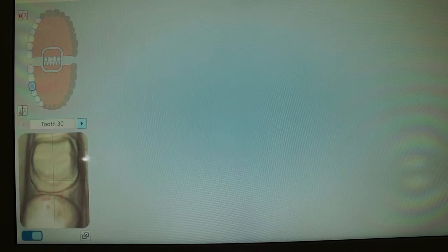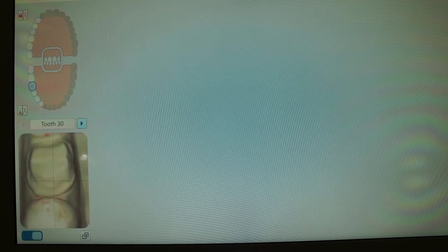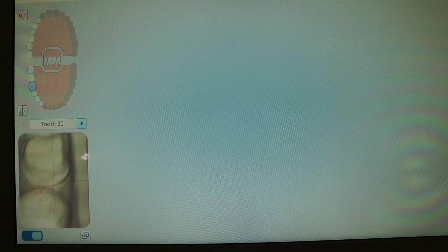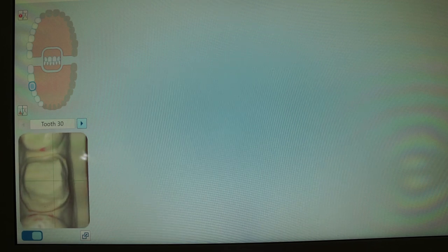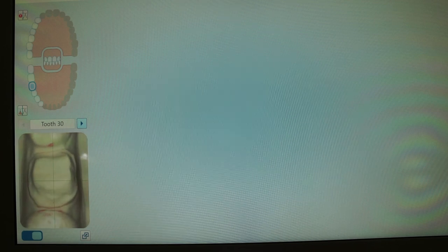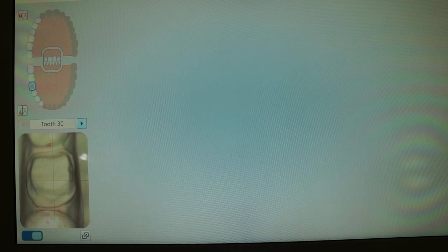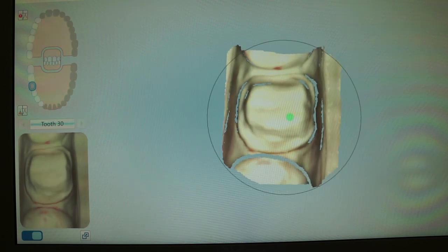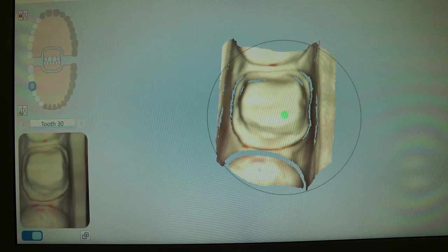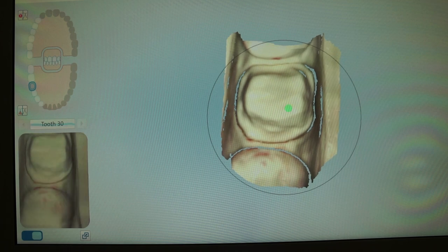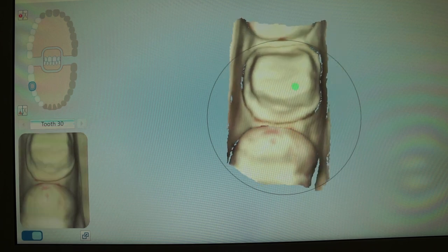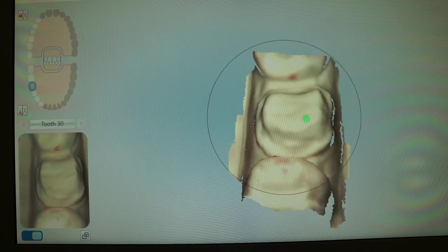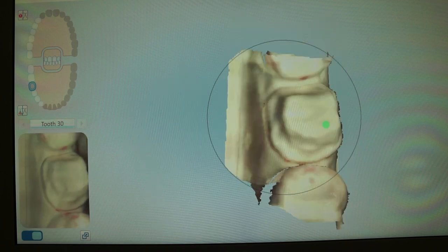So when you scan on the iTero for a restorative workflow, basically it will prompt you to scan your preparation first. And you see those crosshairs on the scanning screen? You basically want to have those over your preparation. You're telling the scanner, basically, this is my prep.